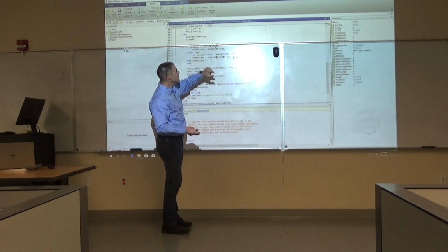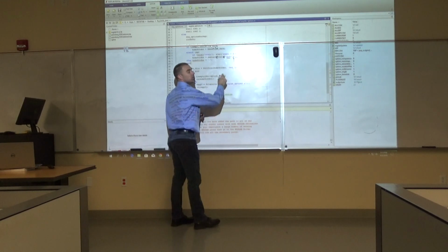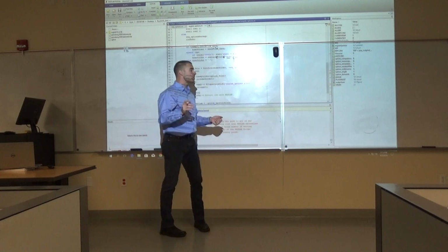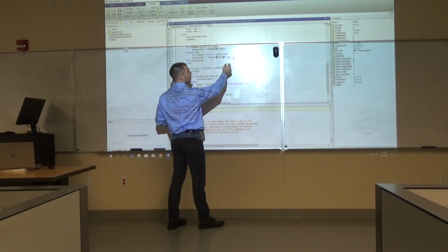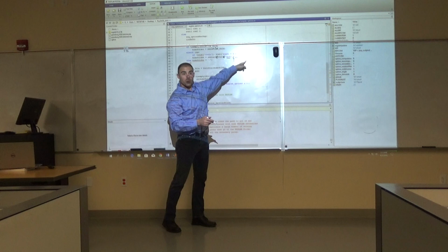Anytime you put something in these apostrophes, it's going to make the color of those letters purple. And the colors are really useful and helpful to us because they basically become a name that you can think of. So, Alex, correct me if I'm wrong, you replaced this with your username? I replaced it with the path to the actual folder that we're working in.